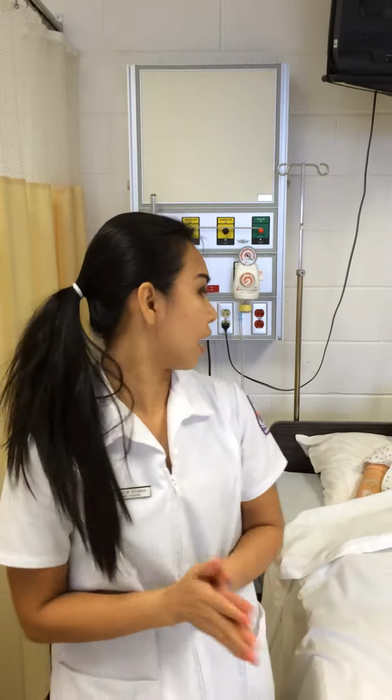So first, we begin with the 7 steps. I check the physician order. I introduce myself. I identify the patient. I set up my equipment. I wash my hands. I explain the procedure, and I provide privacy.